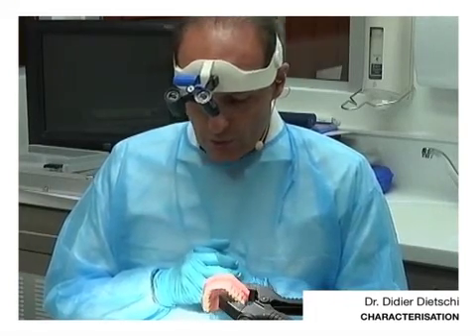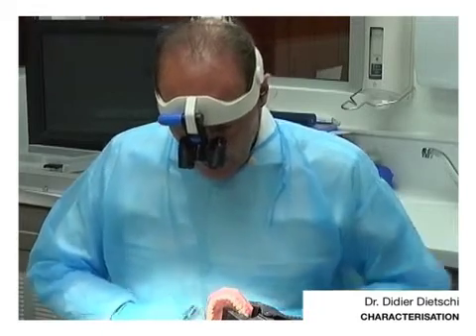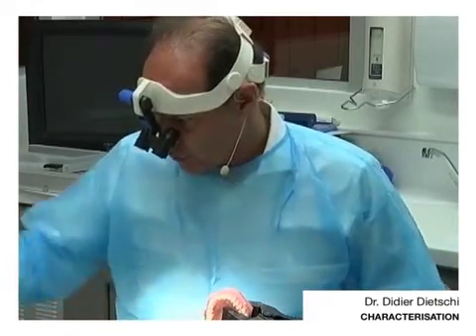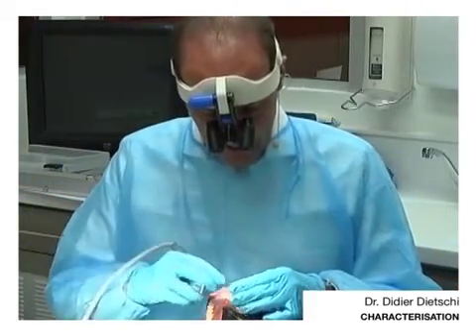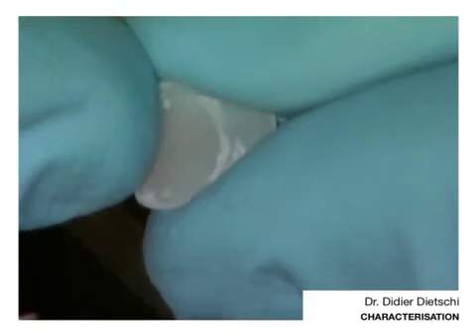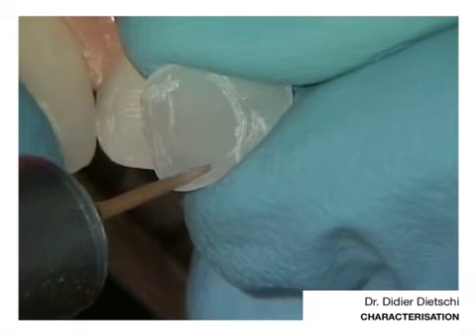If we want to create some incisal hollow, we will have to grind a little bit inside the veneer to create a groove into which the color will stay. Because the risk is that if you try to do that without having created that groove, the color might spread and you won't get a good result. So now I will create a groove with my fine diamonds.